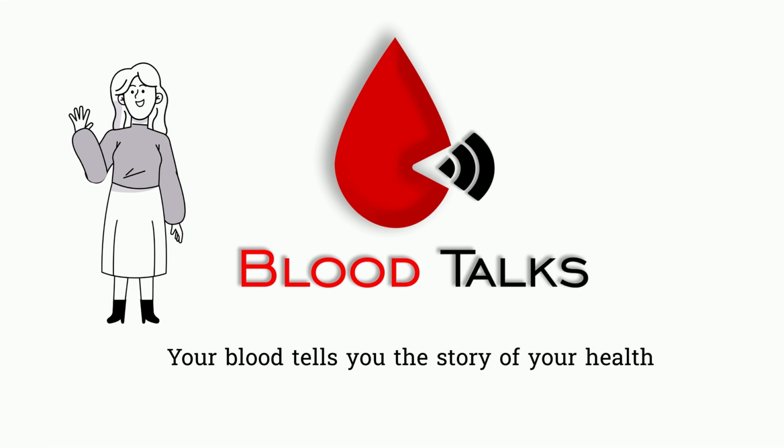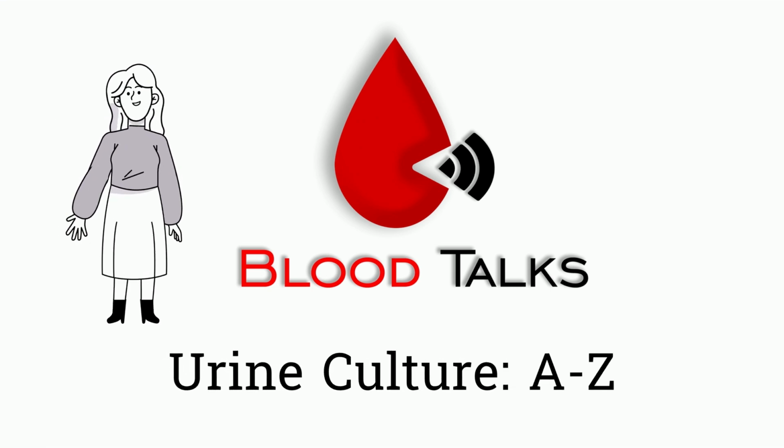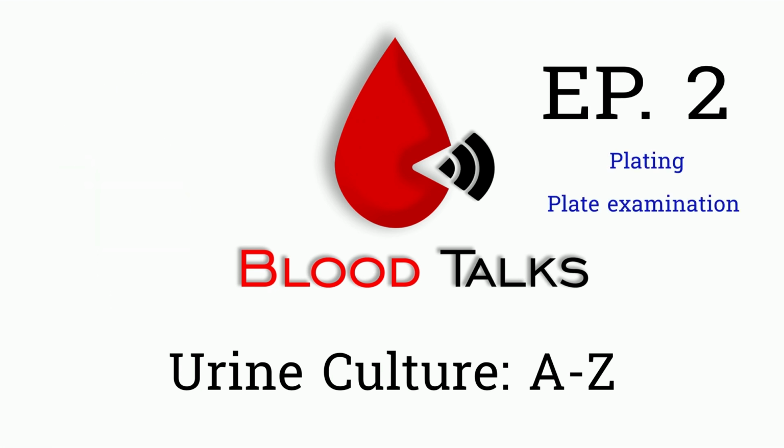Hello talk fans, let's continue on our journeys in urine culture. Today is about urine plating and plate examinations. I will talk about the types of media and why these media are selected. Without further ado, let's get into it.